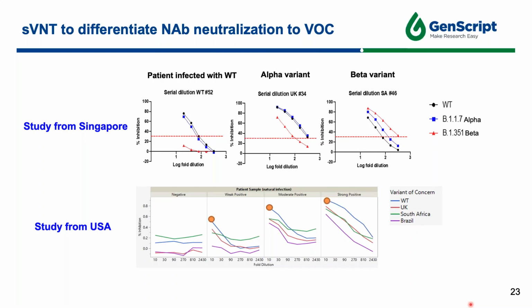So in this study, we observed that people who have neutralizing antibody level that converted to cPass of 80% are largely protected from breakthrough infection. However, we all know that there's no 100% in medicine, and there can be outliers in any population study.